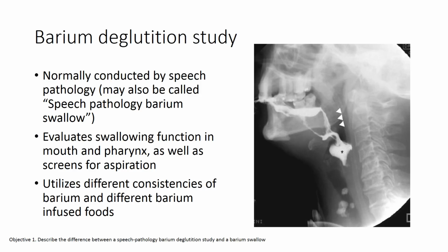They may also sometimes recommend various maneuvers, such as bending the head forward, flexing the head, or flexing the neck while the patient swallows, or putting pressure on one side of the throat, for instance, while the patient swallows, or even putting pressure on the larynx.